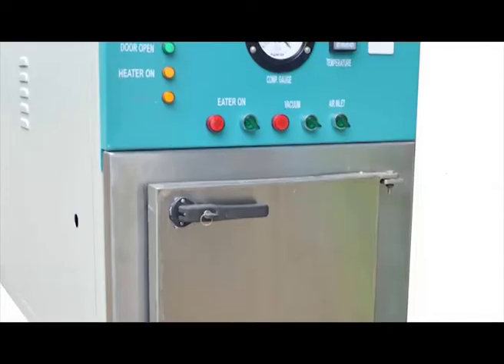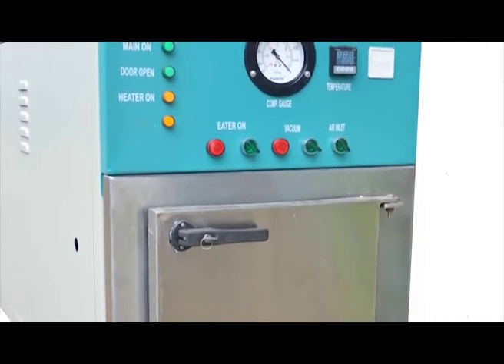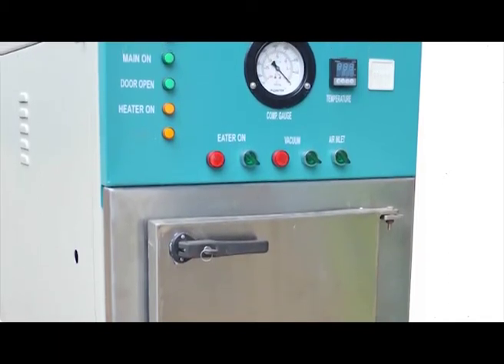Ethylene oxide, ETO sterilization. This is the next type of sterilization. Ethylene oxide sterilization is used for thermolabile reusable medical supplies made of plastic. The sterilization medium is a mixture of ethylene oxide and vapor that penetrates well.